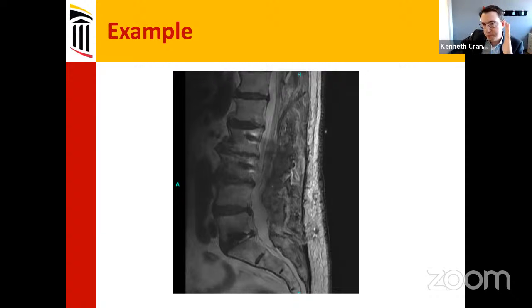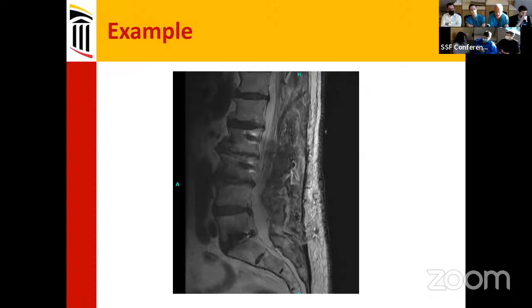But if we didn't have the ultrasound for this case, I don't think I would have had any other option other than to open the dura around the conus, just to check and make sure that it's not being compressed, or to see what's going on inside the thecal sac. So, I'm glad that we had the ultrasound for this case. I think that's a good recent case that shows its utility in an unconventional way. The dynamic of intradural hydrodynamics and space occupying lesions is certainly fascinating.